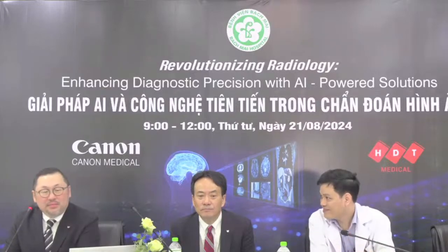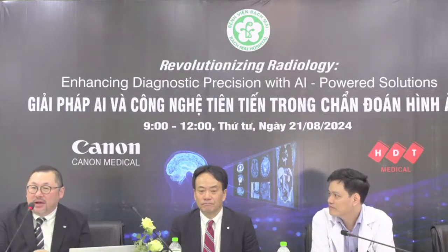So may I add on with the 0.24 second? Actually, now we can achieve for high heart rate that is not more than 100 beats per minute. We can acquire in a 1 heartbeat scan, 1 rotation.